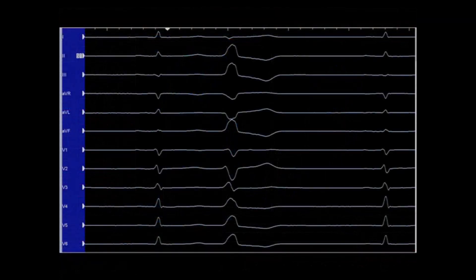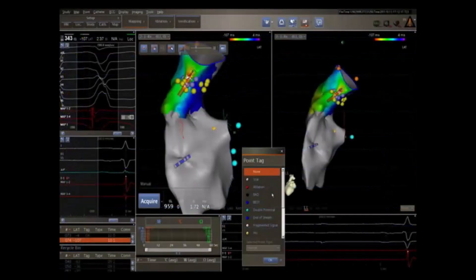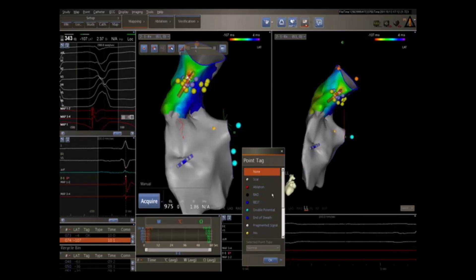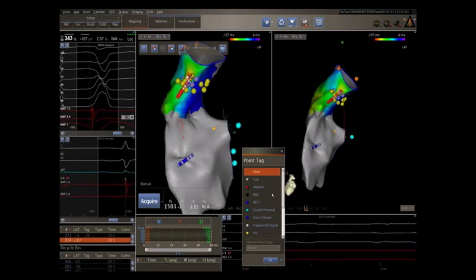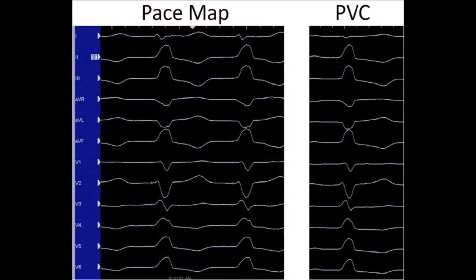In this example, the patient only has rare PVCs; however, only a single PVC is needed to do pace mapping. For this, the ablation catheter is maneuvered throughout the outflow tract with pacing at an energy level just high enough to capture the myocardium. The goal is to find a location with a 12-lead ECG that perfectly matches the PVC — called a 12 out of 12 pace map. It is important to try to match as many of the small notches on the QRS as possible.